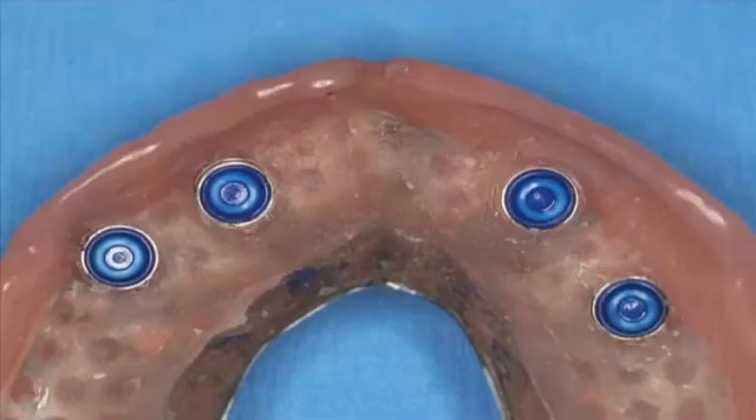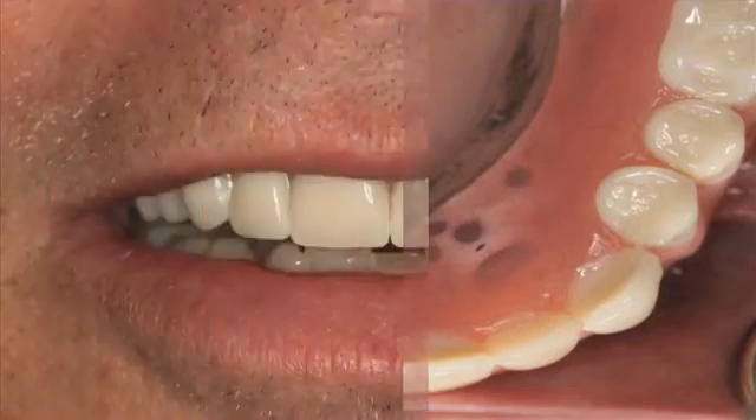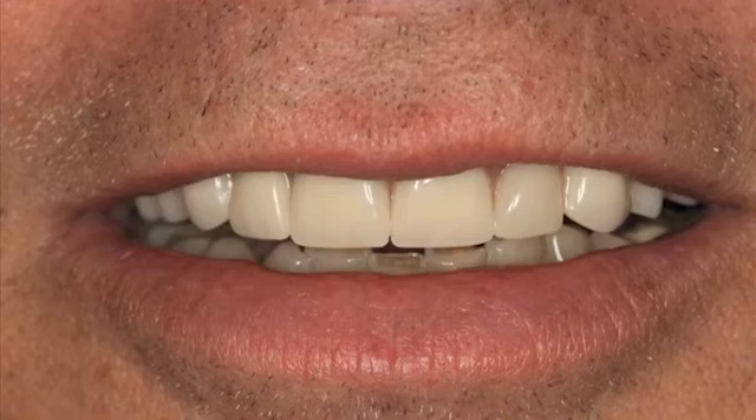The implants are in ideal position. The retentive male locator attachments are placed in the palate-less implant-retained maxillary complete denture. These locators are available in different colors indicating different levels of retention, and they are very easily changed if needed over time — normally the attachments are changed about once a year. Figures 29 and 30 show the palate-less implant-retained maxillary complete denture placed in the mouth. It is stable and functional. The patient was pleased with the natural-looking final prosthesis, with tremendously increased masticatory ability — form and function are definitely improved.